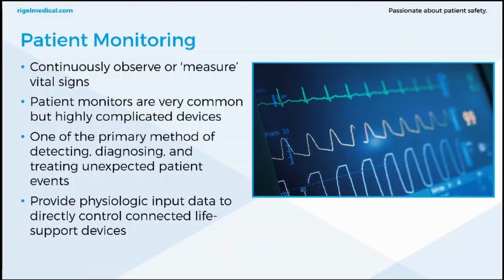So patient monitors, what do they do? They continuously observe or measure vital signs. Patient monitors are very common but highly complicated devices. It's one of the primary methods of detecting, diagnosing and treating unexpected patient events. They provide physiological input data to directly control connected life support devices.